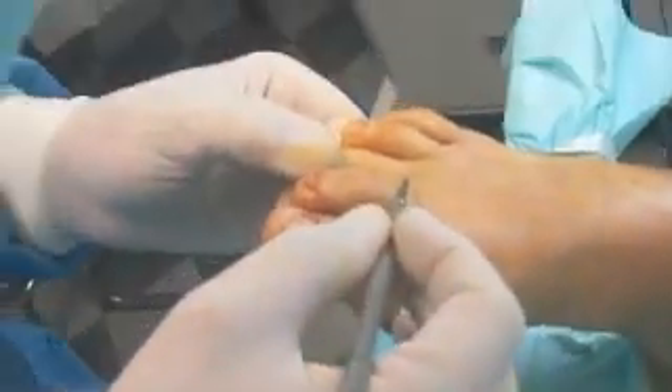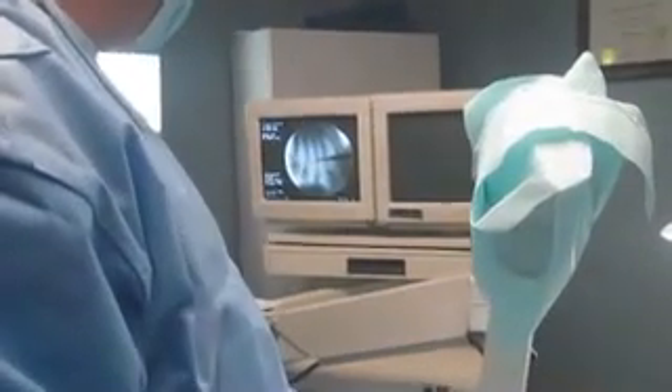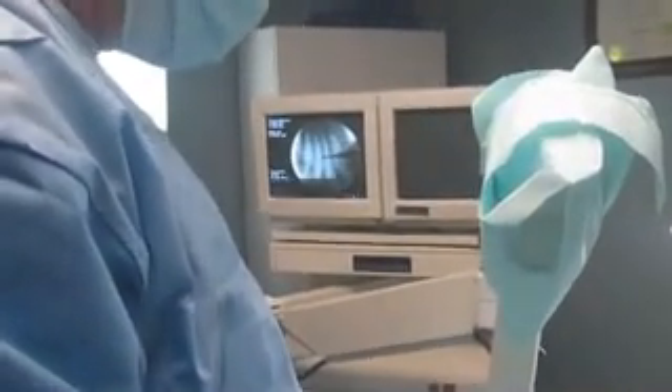We've got the patient numbed under a local anesthetic here in the office, still doing sterile technique. We basically take our C-arm and get our exact positioning where we want to start the procedure. I've got my incision — we'll start right behind the metatarsal neck area right here on the third metatarsal. You can look at the C-arm and see that. In this area, we're just going to make a punch right down to the metatarsal, following our C-arm.